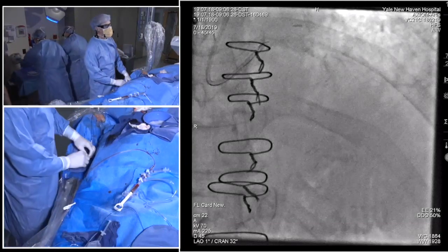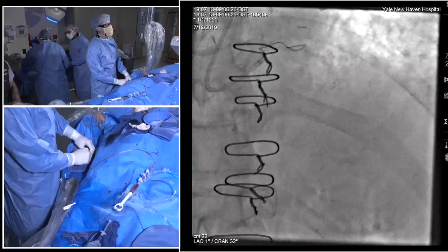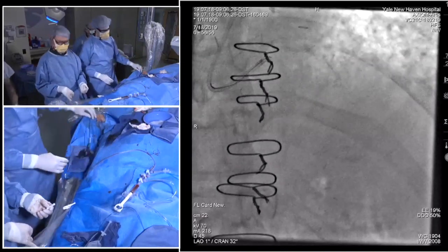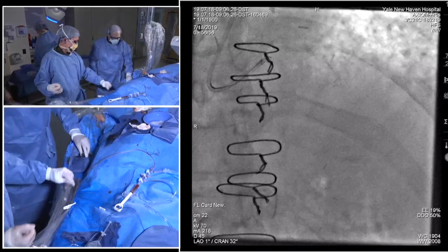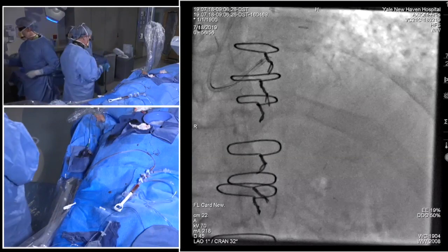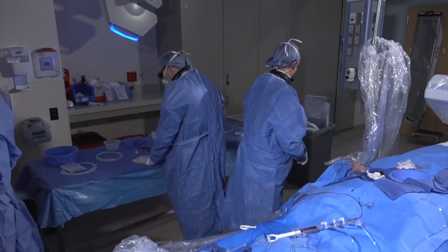The other reason to do the IVUS at the post-balloon step, which many people omit, is because you want to be sure, number one, of stenting with appropriate size, but also if you see fracture in the calcium, then you know you're going to expand your stent more effectively. So you have the catheter open. There's really little downside to using it unless the patient's hemodynamically unstable. So we then do go back at that stage to sort out what's going on.